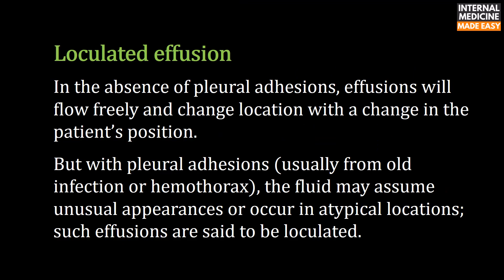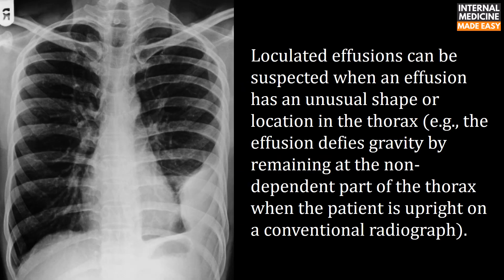Loculated effusion: In the absence of pleural adhesions, effusions will flow freely and change location with changes in the patient's position. With pleural adhesions, usually from old infection or hemothorax, the fluid may assume unusual appearances or occur in atypical locations — such effusions are said to be loculated. Loculated effusions can be suspected when an effusion has an unusual shape or location, for example defying gravity by remaining at the non-dependent part of the thorax when the patient is upright.